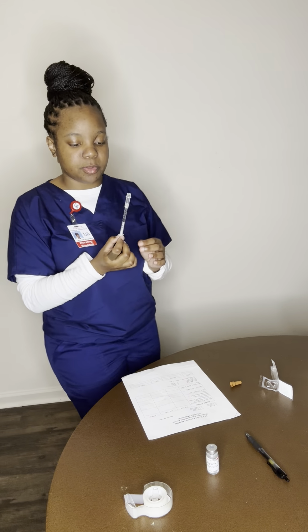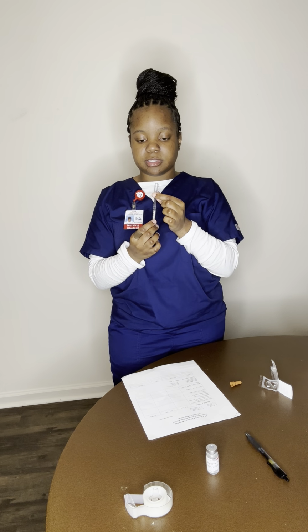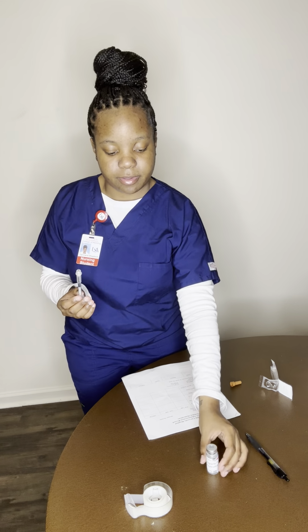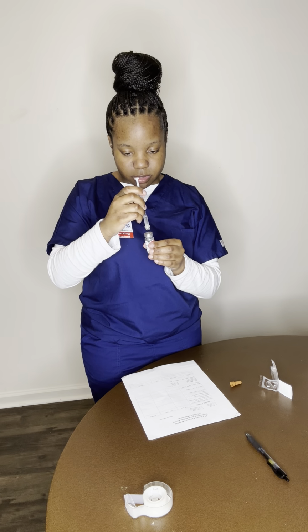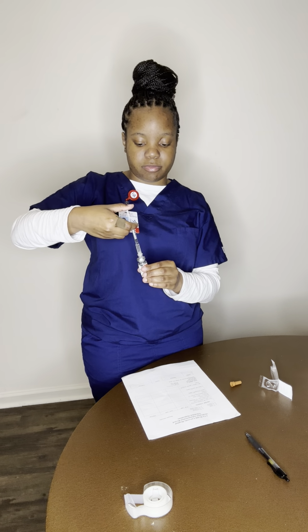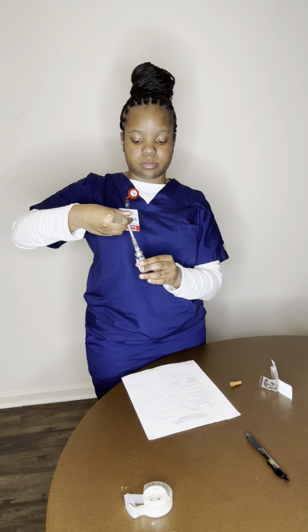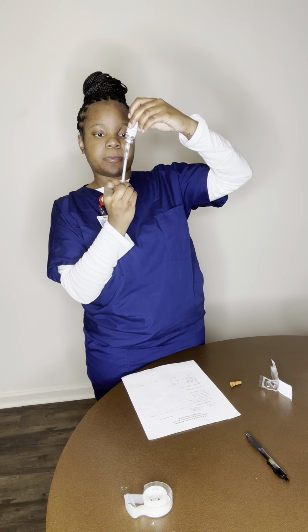So now I am going to take off the safety. I'm going to grab my vial. I'm going to plunge it. And I'm going to release the air into the vial. I'm going to flip it open. And I'm going to pull out 0.5 milliliters.